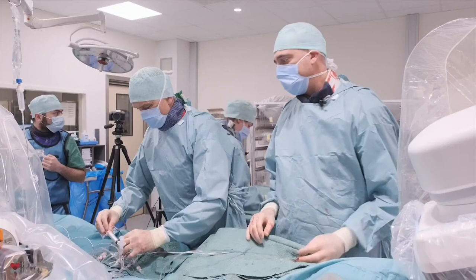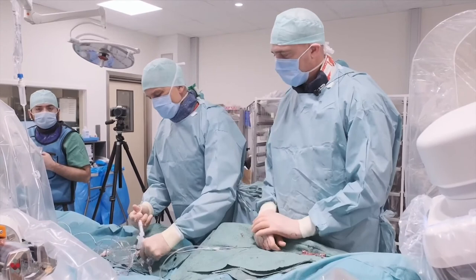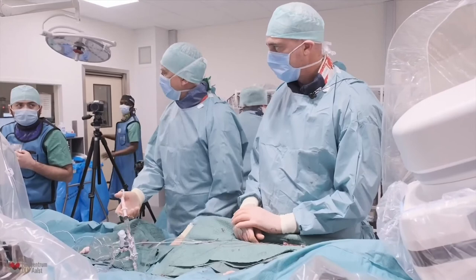Okay, we prepare again for a papaverine injection. Going to flush the catheter with saline as we always do. I take 3 cc, which means 12 milligrams of papaverine for the left. In the right we have injected and we are ready. We are ready to go. You can record.